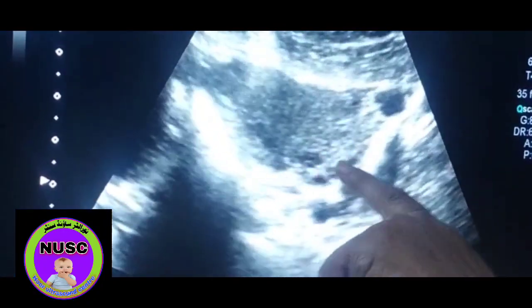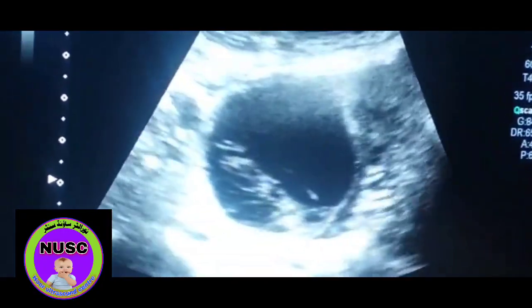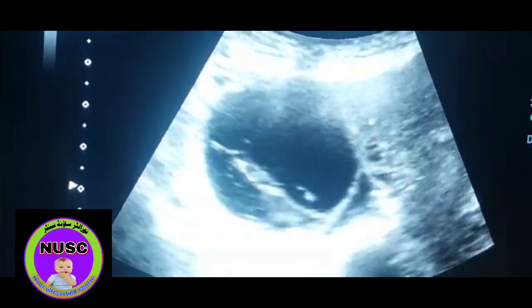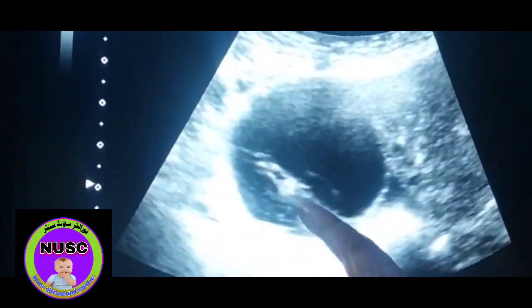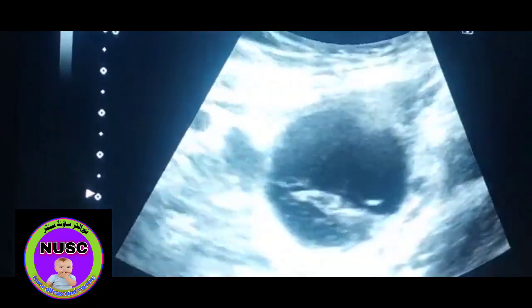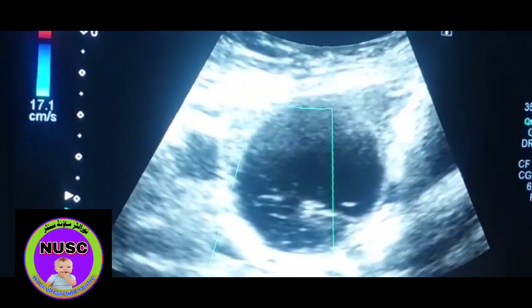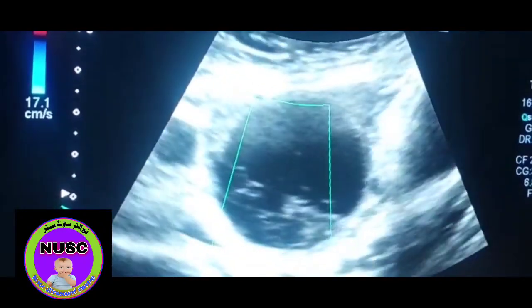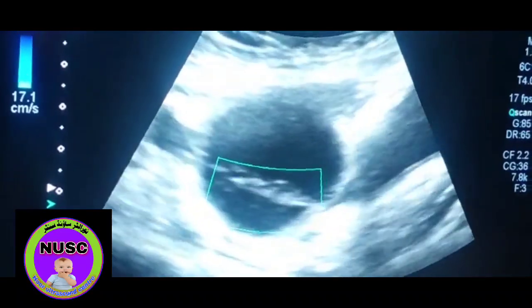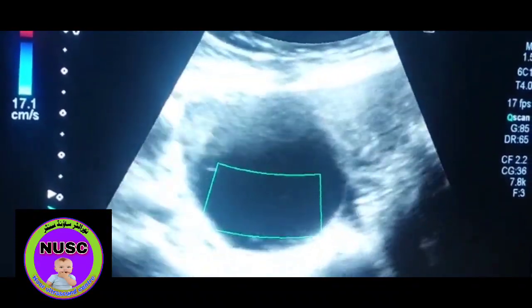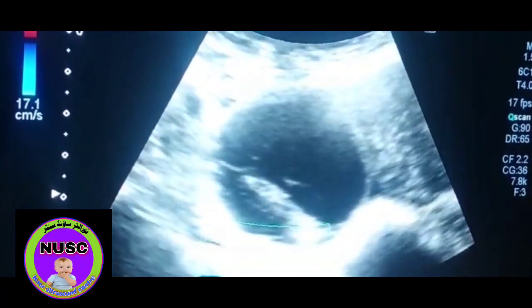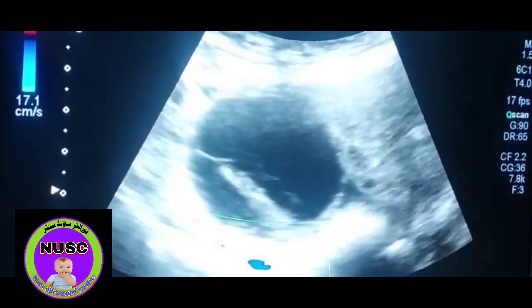This is the left ovary. And this is a hemorrhagic cyst in the right ovary — hemorrhagic cyst. This is a retracting clot with fine septals. There is no blood flow inside, and there is no blood flow in the septals.